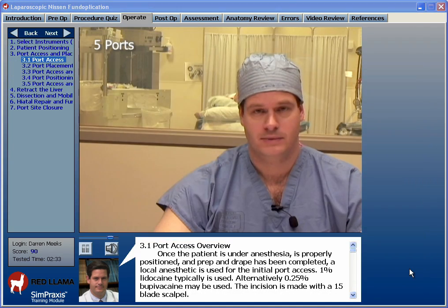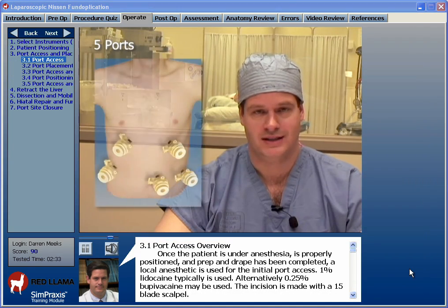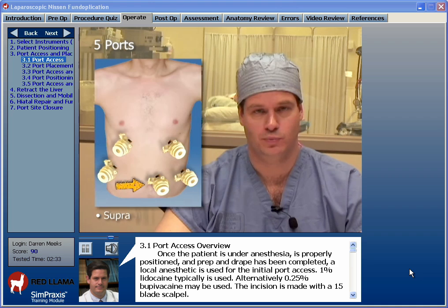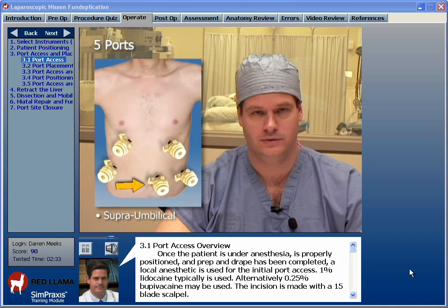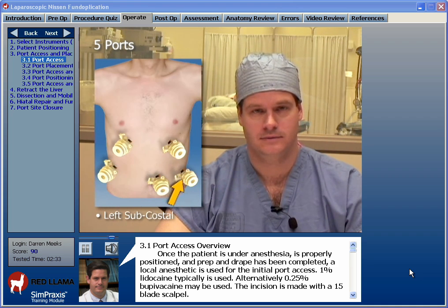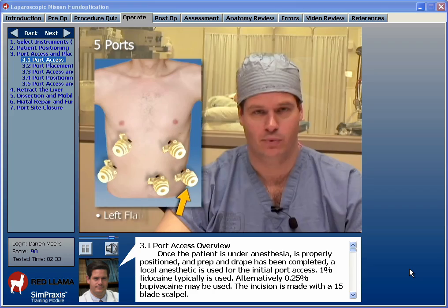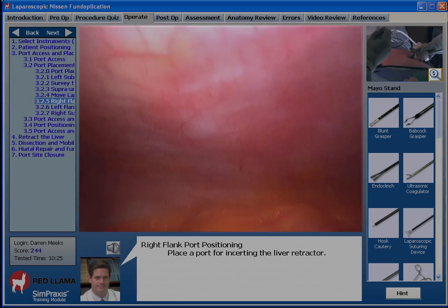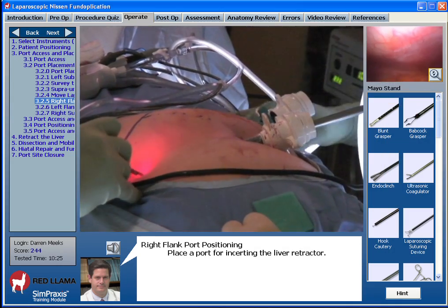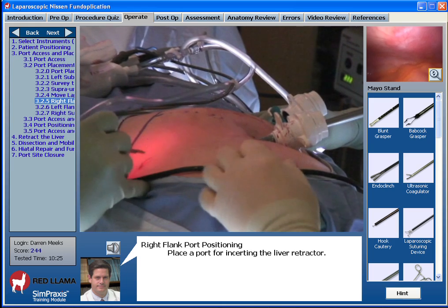There are five fundamental ports used in the laparoscopic Nissen fundoplication. Port access, port placement, and diagnostic laparoscopy are introduced both interactively and with complete didactics in the port positioning section. During the training, you can view both an internal and external view of a particular step.